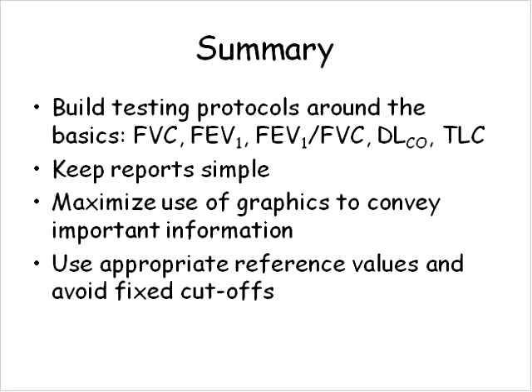So I think there's a lot of good reasons for measuring the slow vital capacity, and I've just mentioned a few of those. Hopefully, if you're not thinking about that at the time you're doing the testing, you may want to consider adding that to the test if you're not doing it already.